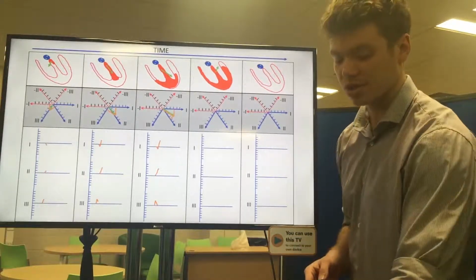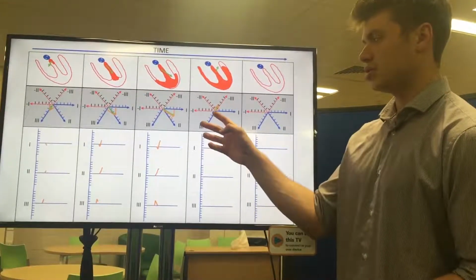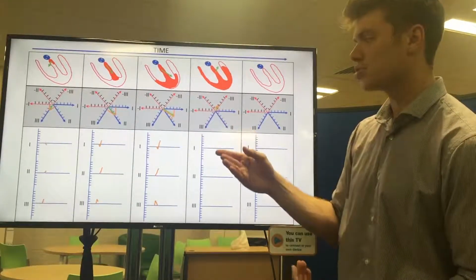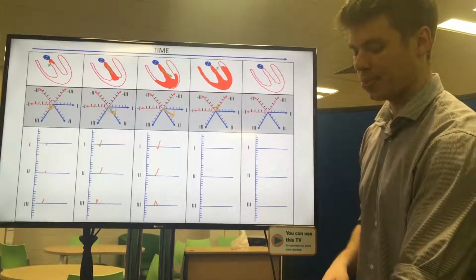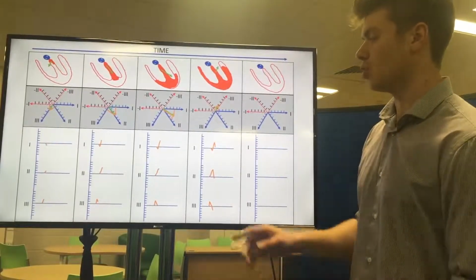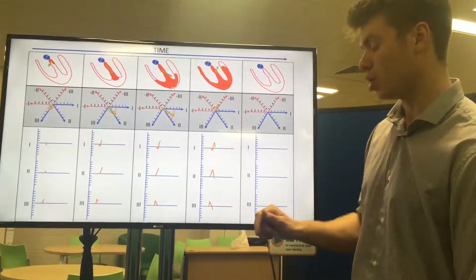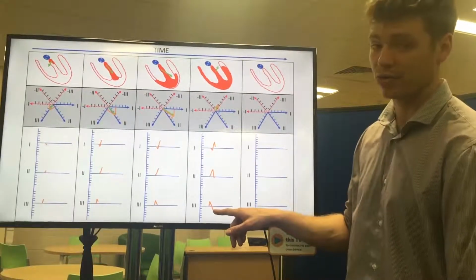Okay, so this is what I got from that. I just copy and pasted the vector and saw how far across it went on leads 1, 2 and 3. I saw that it went to the positive end of lead 1 and it was just less than 1 unit across. It went to the negative end of lead 2 and again it was almost 1 unit across on the negative side, and in lead 3 it went to the negative side, about 2 units across. So moving everything from here to here and then adding what we found, lead 1 is positive, but it's just below the 1 unit line. Lead 2 is negative and just below the negative 1 unit line. And lead 3 went to -2, so it's already gone quite far down for an S wave in lead 3 there.